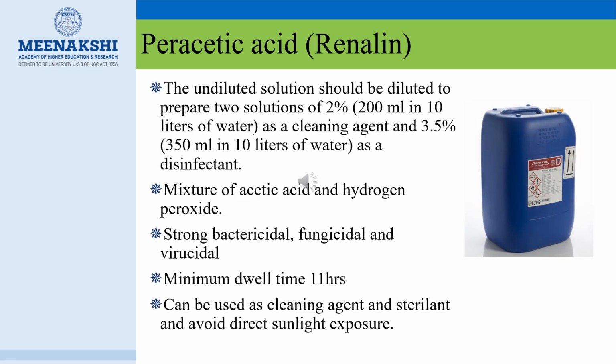Peracetic acid or Renalin is a mixture of acetic acid and hydrogen peroxide. It kills bacteria, fungi and virus. Minimum dwell time will be 11 hours. It can be used as a cleaning agent or sterilant and should avoid direct sunlight exposure.